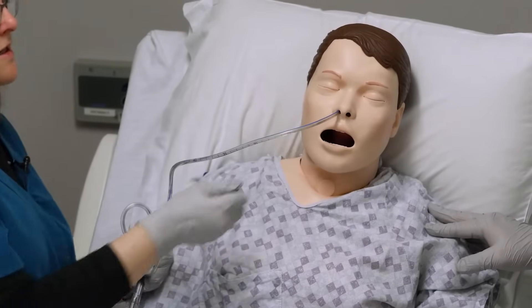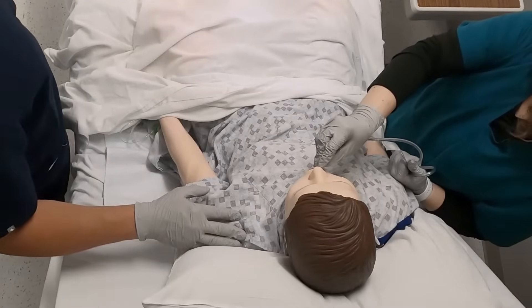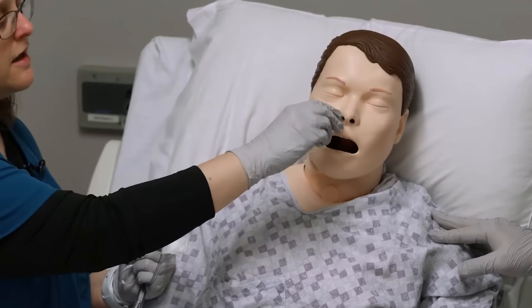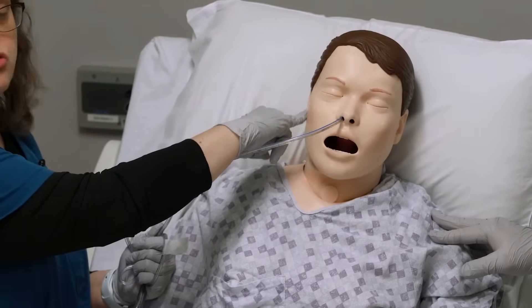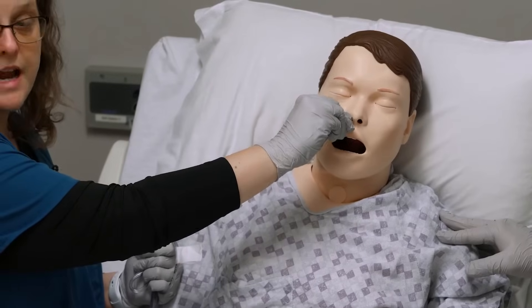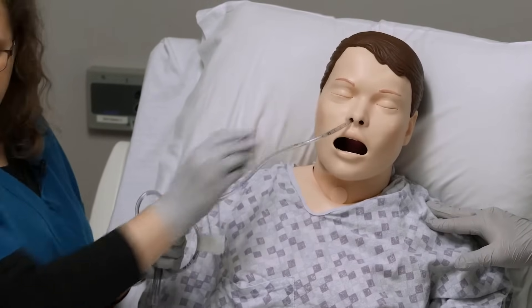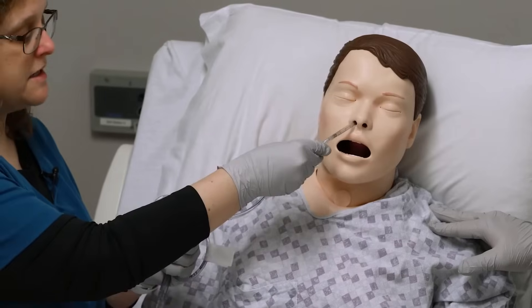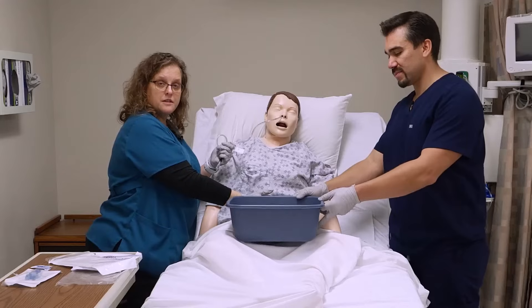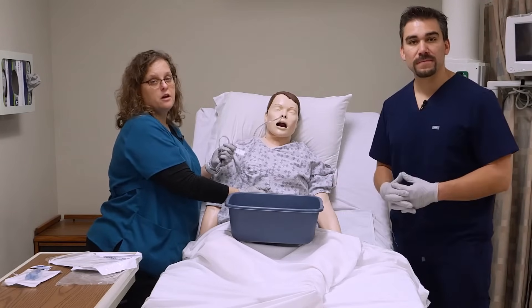This is the part where I'm going to say, 'Do you feel okay? Is this all right?' Because they're going to start to gag. As she's starting to gag, it's also hitting structures in the back of her throat where I'm going to want to rotate this a little bit so that it goes down easier. She's probably going to start to cough. That big basin is here because if she's really distended and we're going to have to do a lot of suction, she's probably going to vomit a large amount.